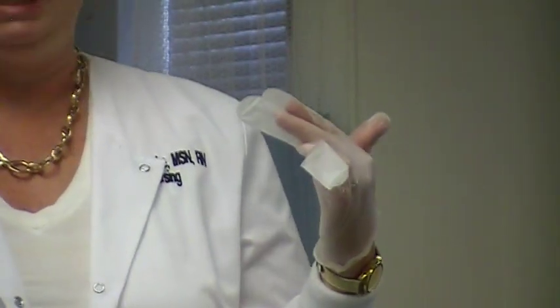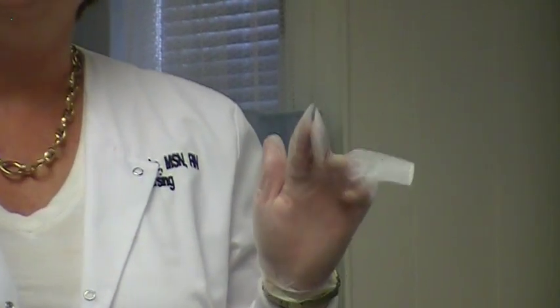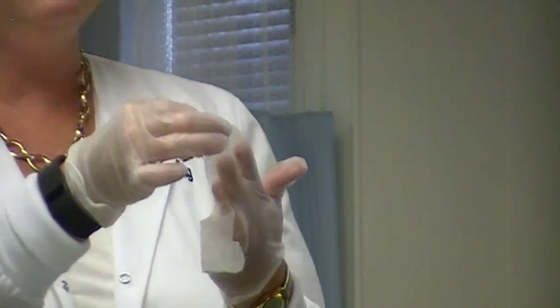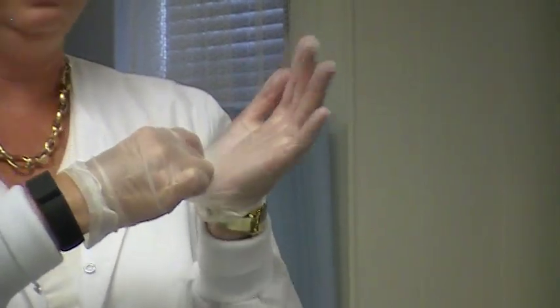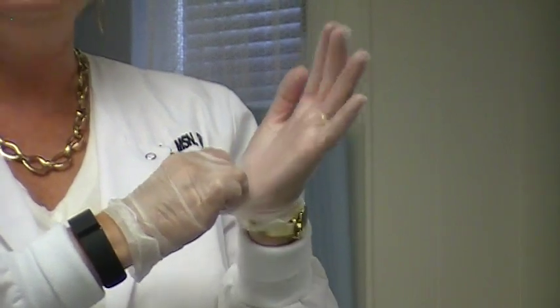Now, this is something that happens quite frequently, and it can even happen with the other hand: you get the glove on, but you don't get all the fingers in the right spot. That's okay. This hand is sterile, this hand is sterile. So now I'm just going to take a little time to get all of my fingers in the right grooves. Then I just pull right here, at my palm, and pull it down.